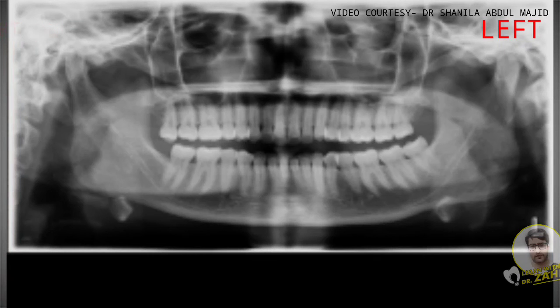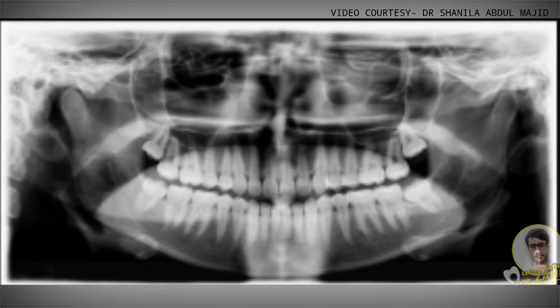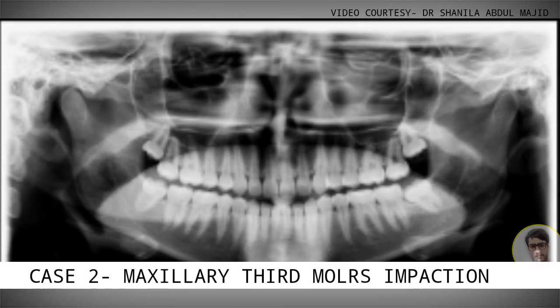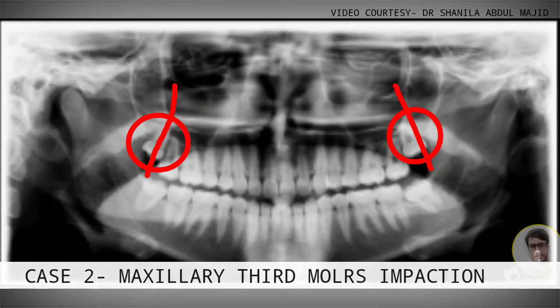Next we move on to the pathologies seen in the OPG. This is an impaction case wherein you can see both maxillary third molars are impacted — this is more of a vertical impaction. This can be identified by the long axis of the 8s when compared with the long axis of the 7s, which is how we determine the angulation of third molar impactions.